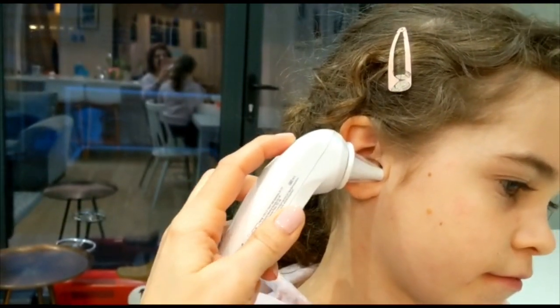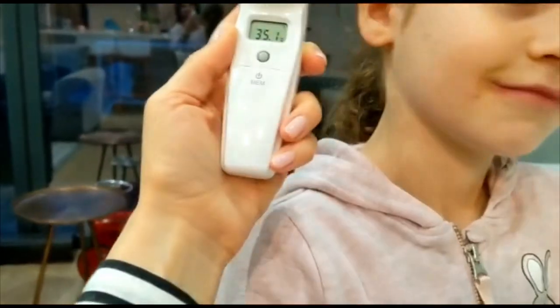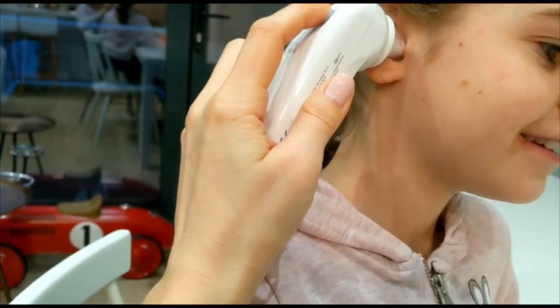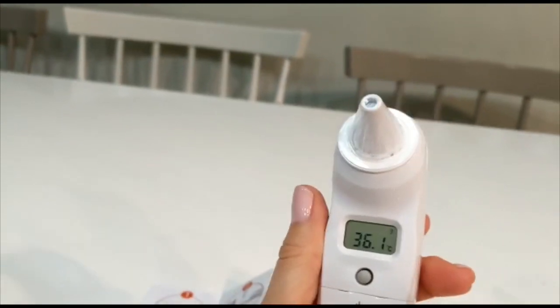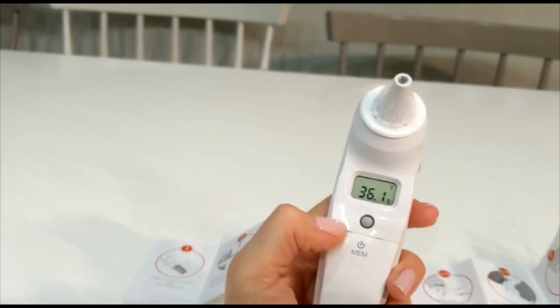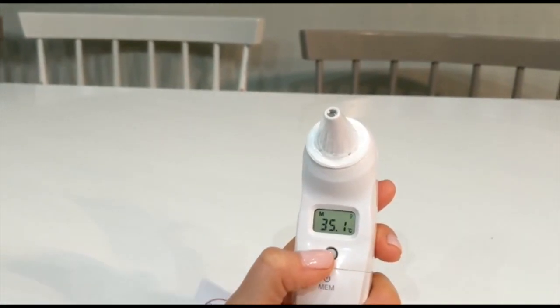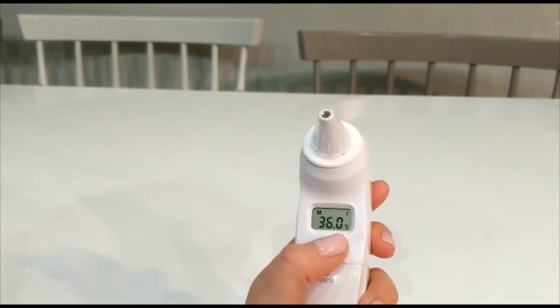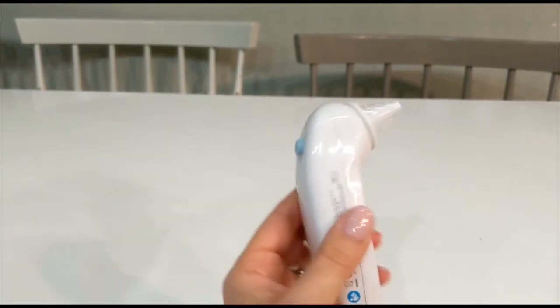So 36.1, I think you are nice and healthy. And then if I want to look at previous recordings, press that button. Here's my low recording and here are the previous ones that I've done. So it really is that easy. It will turn itself off after a while if you're not using it.